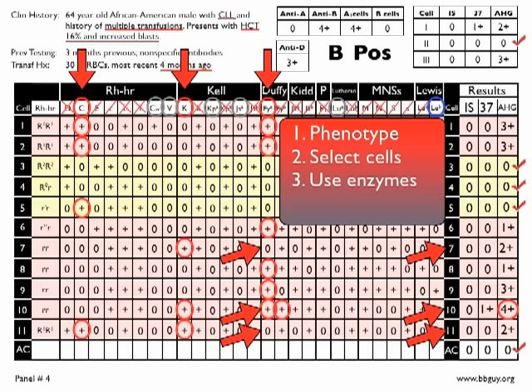You should also know that alloadsorption is something you could do. For example, you could get a big C positive, big K negative, Duffy A negative cell and adsorb out an anti-big C from the mixture, do an eluate, and identify the anti-big C. So that can certainly be done. That's more for the next, the more complex podcast. We're going to stick with the simple stuff now.